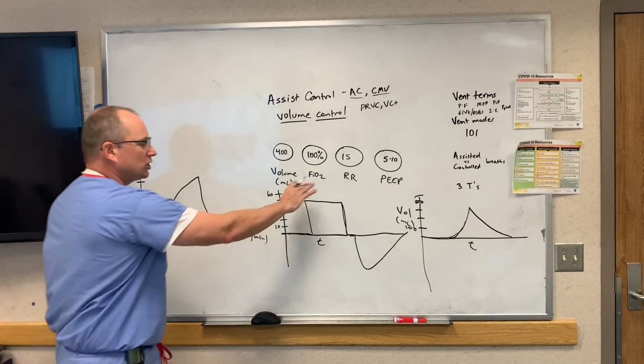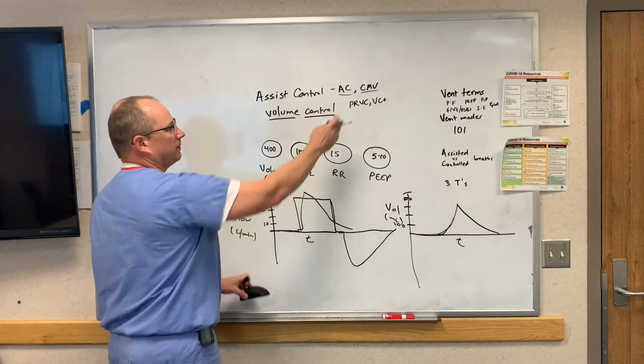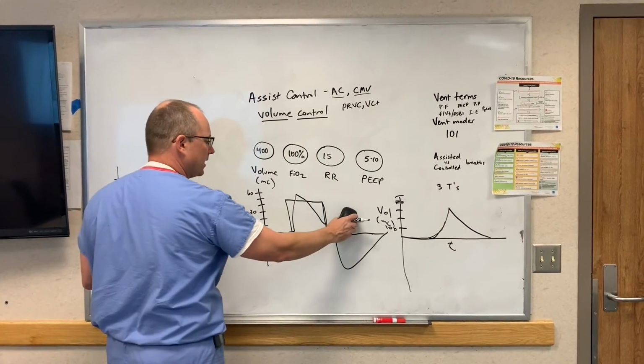And then we can sometimes change these flow parameters and make them look a little bit different, and to make it a little bit more comfortable for the patient, use these other modes. I wouldn't worry about that too much for right now.